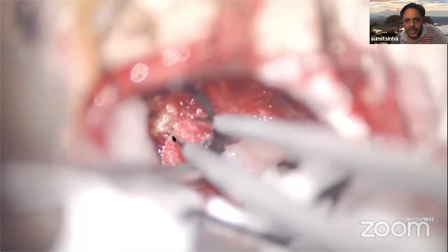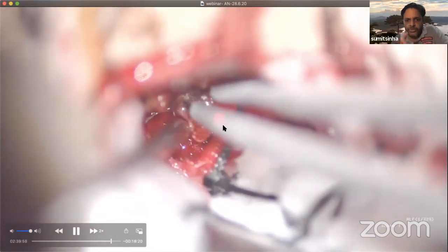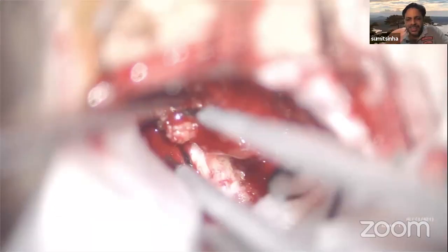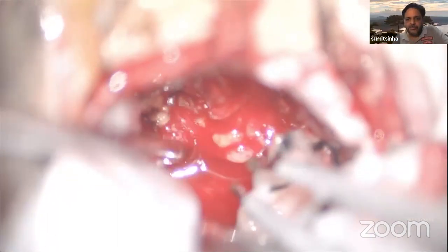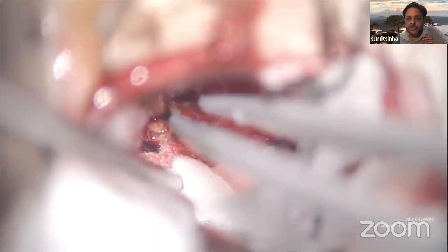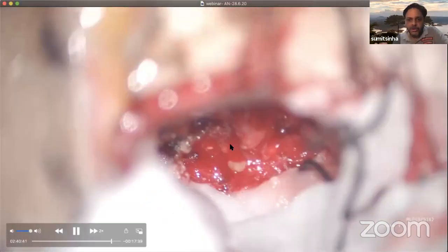So the last stages of the tumor removal. This is very important. I mean, this is the most important step of the surgery. In every surgery, I compartmentalize the steps by priority of importance. And this is the most important step because this is the last bit of the tumor tissue which remains attached to the facial nerve and requires removal. Approximately half of this last bit of the tumor has already been removed.